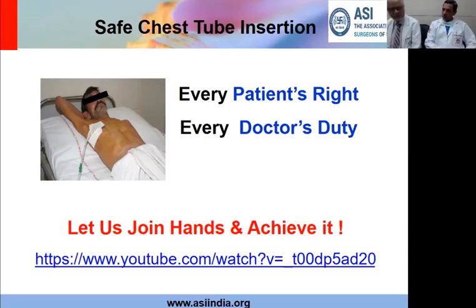One related point on the technique of insertion. Some people have mentioned that after you enter the pleura, you put in a finger to make sure that one has gotten to the pleural space, and also to take down some of the adhesions that may be present between the lung and the chest wall. Is this a good maneuver, or should it not be done, or will it make your incision larger and be counterproductive?